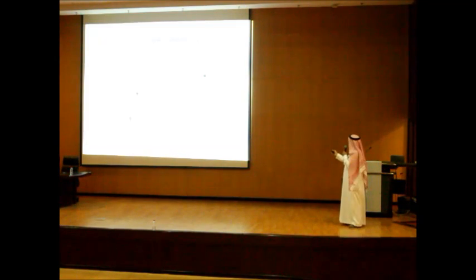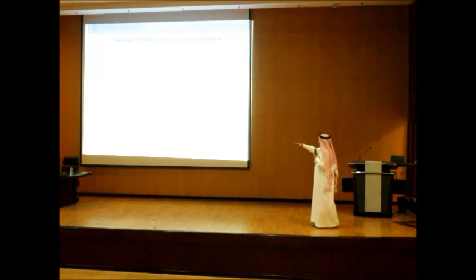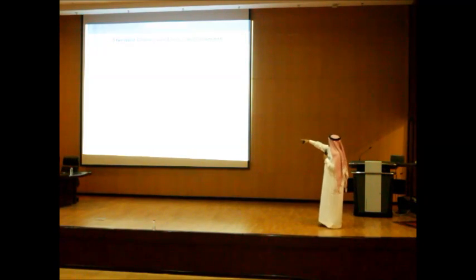So these are the limb leads. And then we have the chest leads. The chest leads are made of 6 leads. The first one is in the fourth intercostal space on the right side. Lead 2 is in the fourth intercostal space on the left side. Lead 4 is on the mid-clavicular line, fifth intercostal space. Lead 3 is in between lead 2 and 4. And lead 5 is on the anterior axillary line, and 6 on the mid-axillary line.